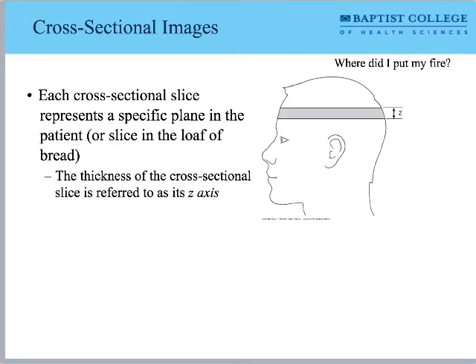So the idea of cross-sectional images is directly tied to CT. We all had to take cross-sectional anatomy. That class is basically CT 101, right? Everything that you learned in cross-sectional anatomy, we will be using, even in the course of this class today. As you're picturing this stuff, be picturing those cross-sectional anatomy pictures that you were looking at.